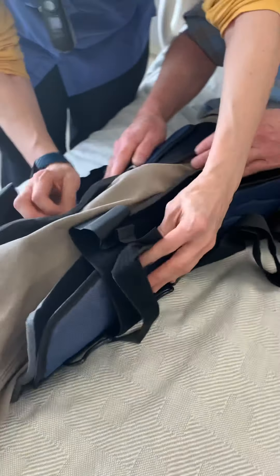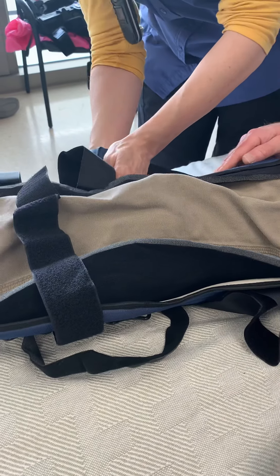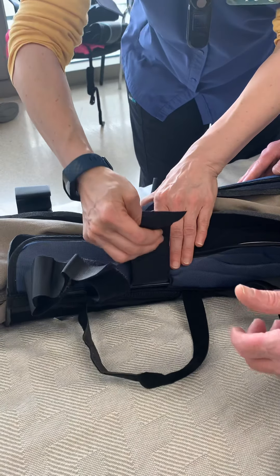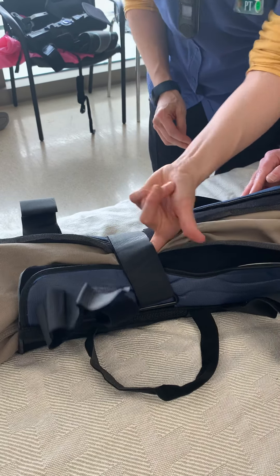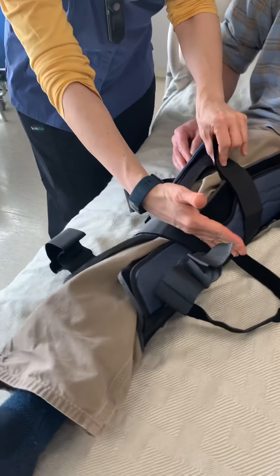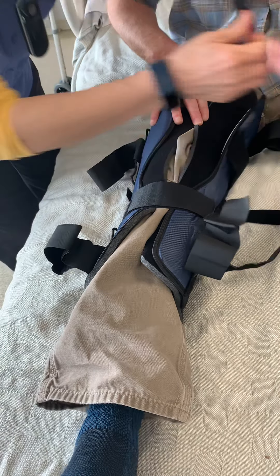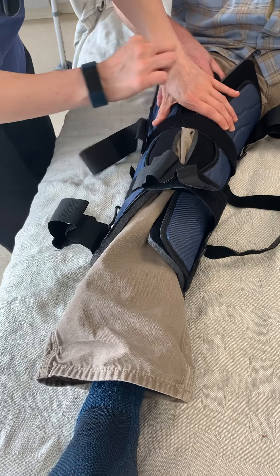So what I usually do when I put it on, I fasten the straps from the center out so that you're stabilizing the knee. You usually want to get it fairly snug — maybe you can get a finger underneath. If you can't get a finger underneath, it's probably way too tight. And odds are for a lot of our patients, we have incisions right there, so they're not real fond of that anyway. But you do the best you can. Center out, center out — center out is usually the way I do it.